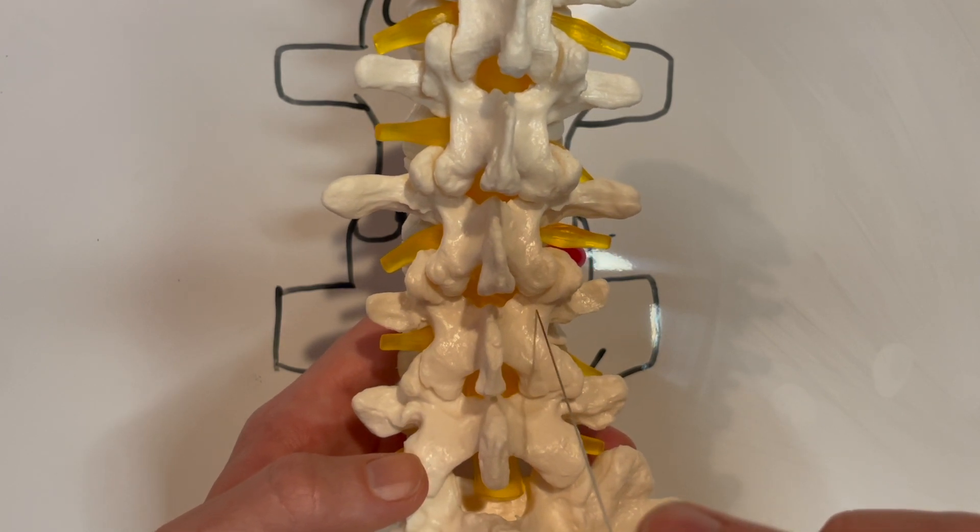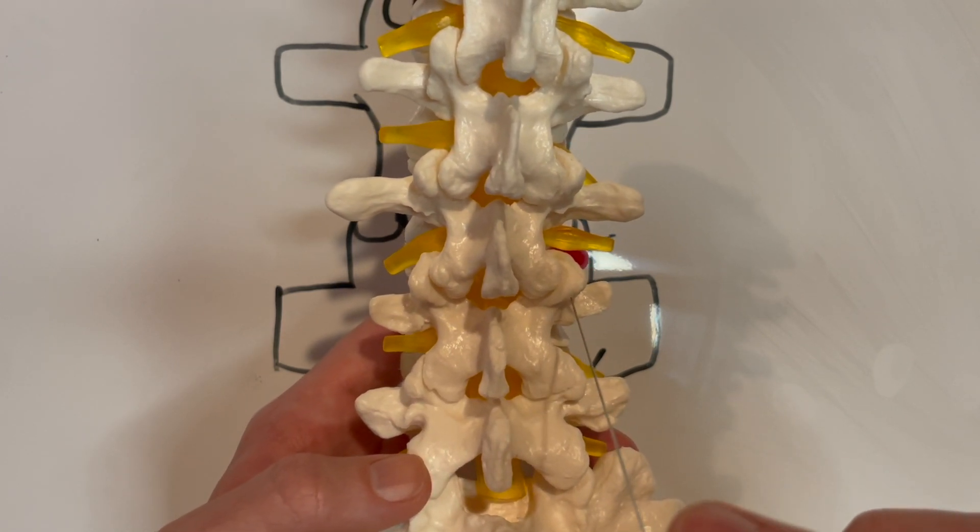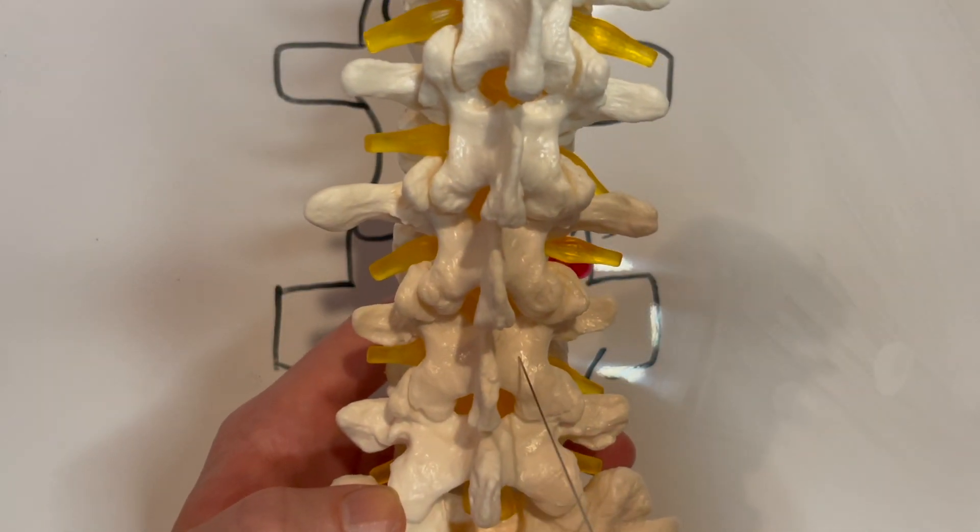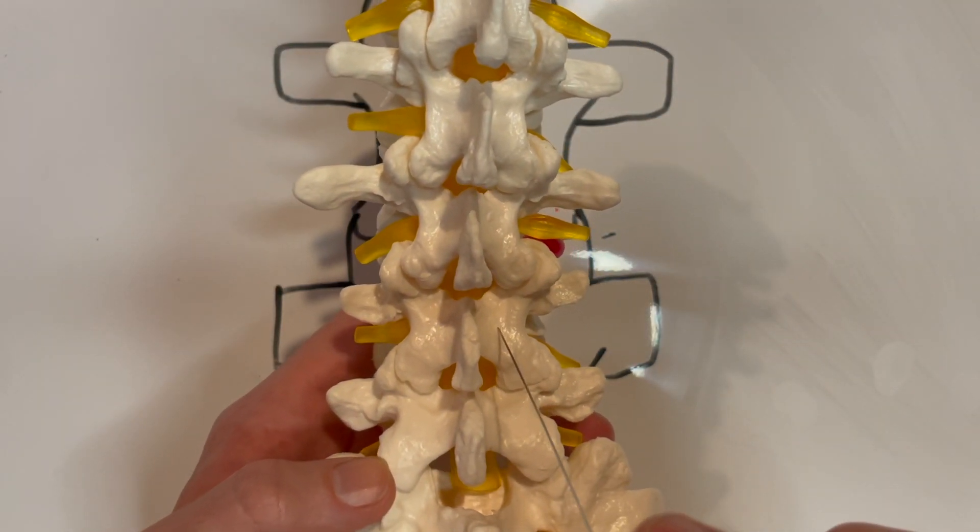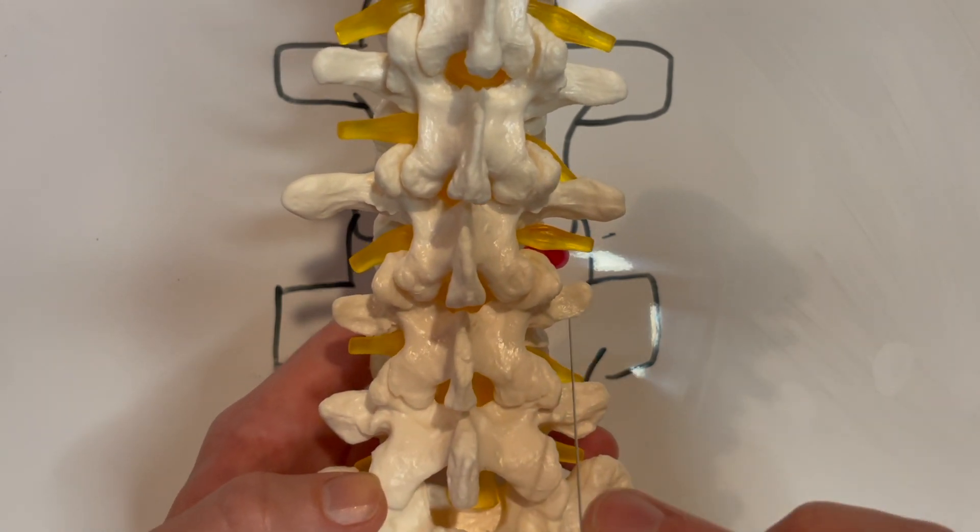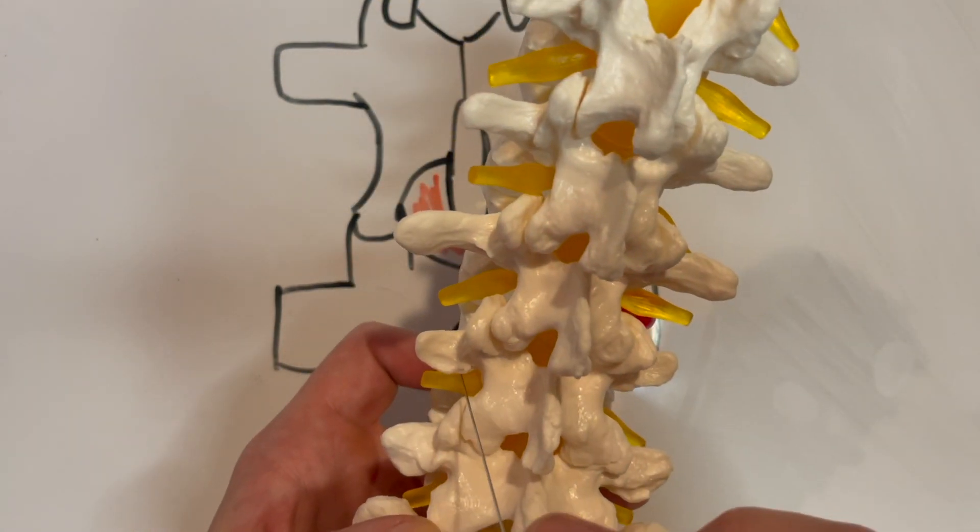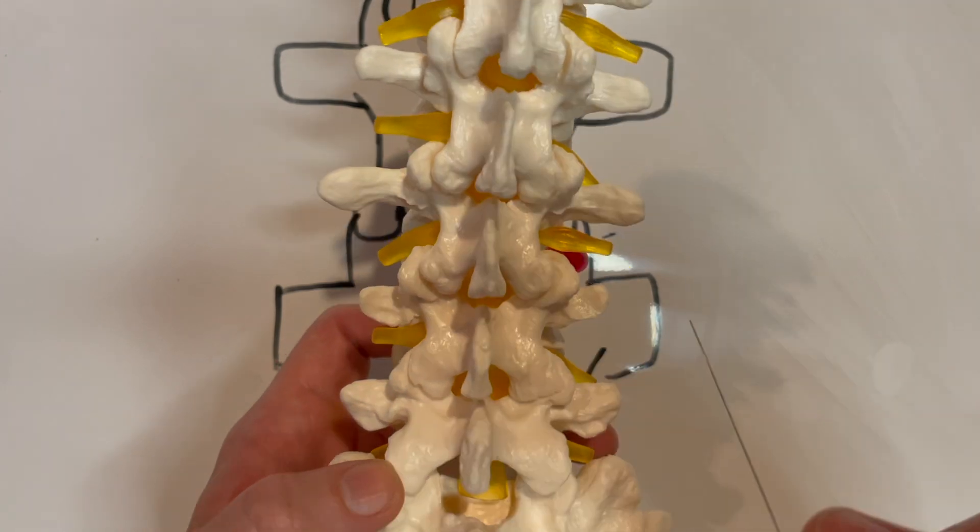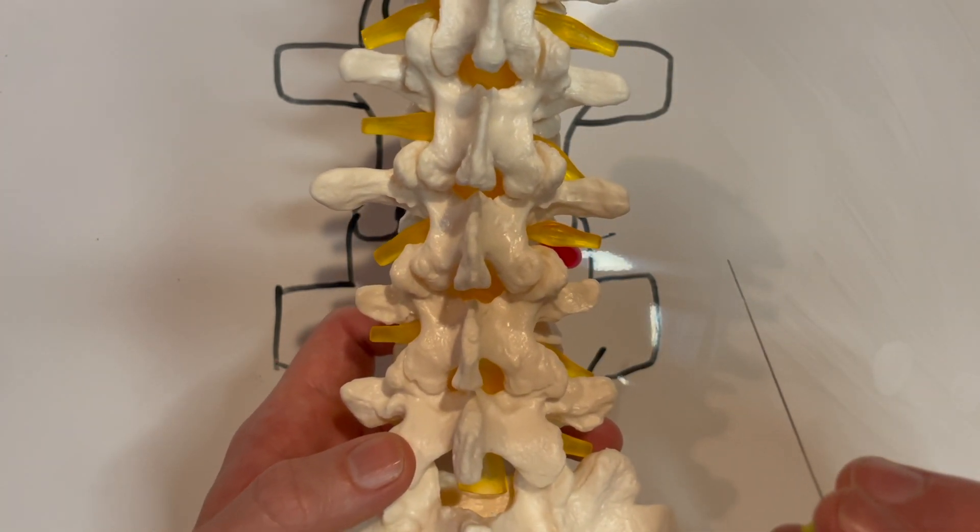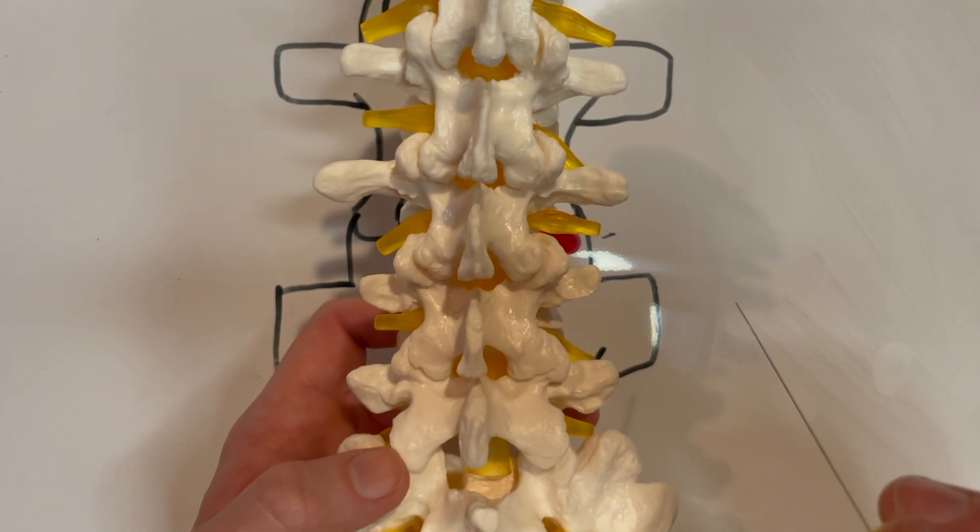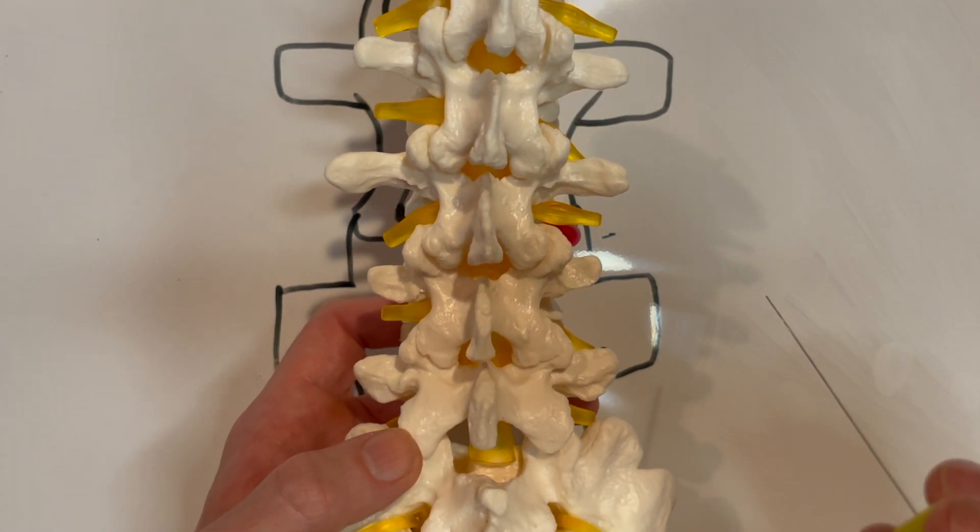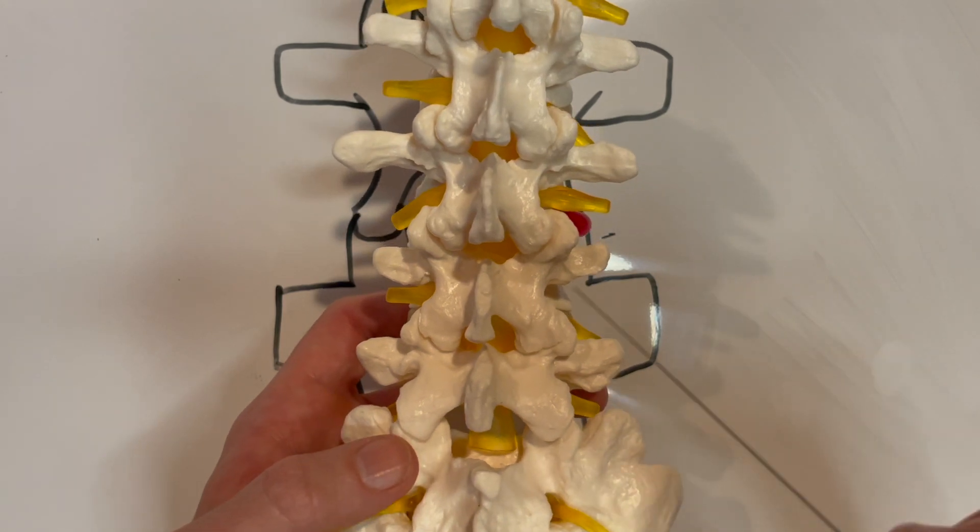And the other spot you can hit—so you can hit the superior articular processes, you can also hit the lamina of the vertebrae off to the side here, and then you can completely go off to the right here or left and just completely miss the vertebrae altogether. That can happen if you have someone who's not positioned properly or has a lot of adipose tissue and just poor anatomical alignment.